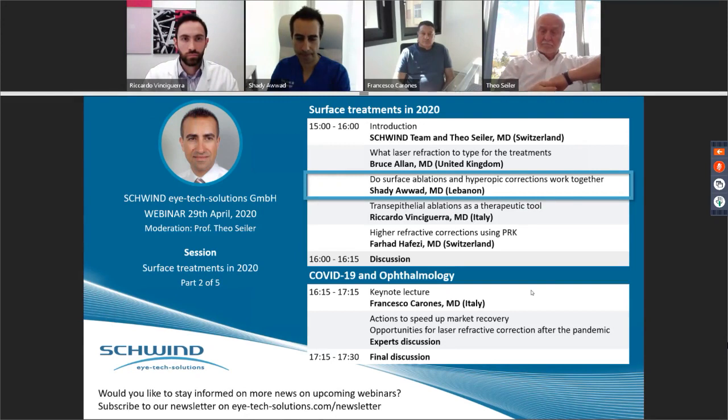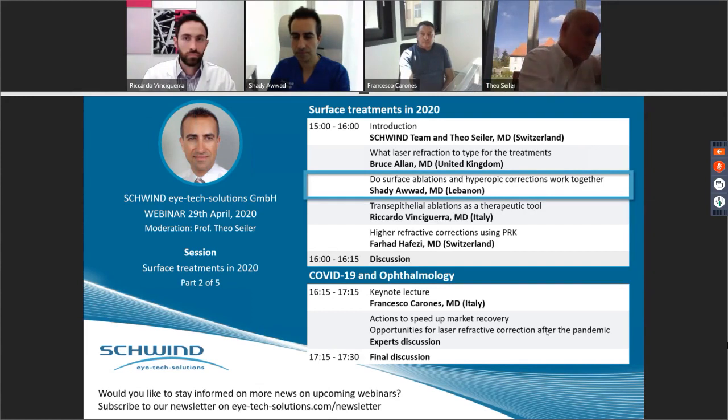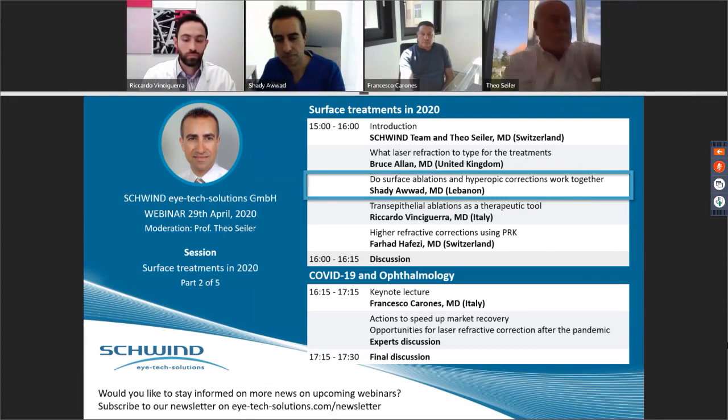One has to be aware that, in particular for surface ablations, the larger the transition zone, the longer it will take for the epithelium to close. It is the only downside to my knowledge. I would be more than happy to have larger and larger transition zones. I don't know if the market is ready for that. I don't know what the users, clinicians, the experts would say.